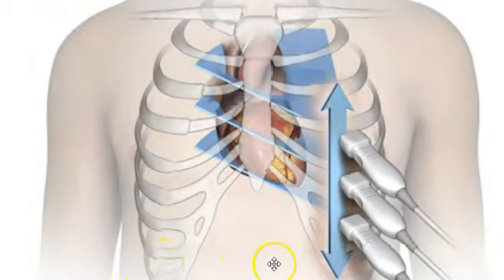And with our apical windows, we can see that we can go up and down to either get down in this position here. We can either get the whole heart aiming through here and cut through sort of this place here, or aim up and cut through here. We can cut through all these different slice planes just basically by staying in the same rib space, but you also can move up a rib space too if you want. But remember what's going to happen. If, say, you're in this position here and you're shooting through the ventricle and got a nice cut through there, if you move up a rib space, what's going to happen is this probe is going to move up to here, and you're going to foreshorten.